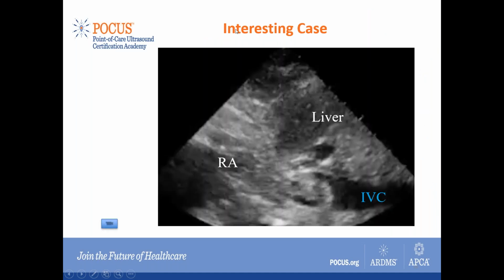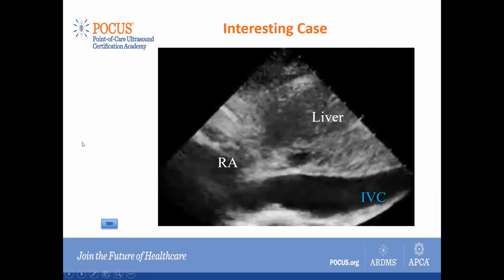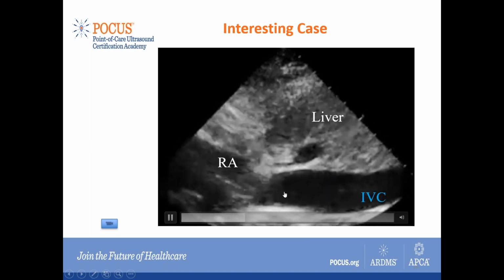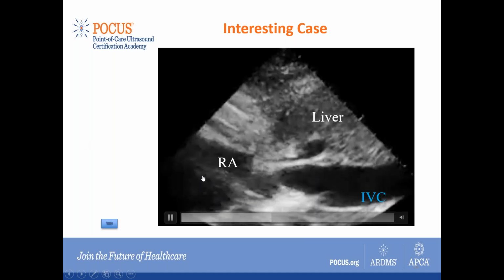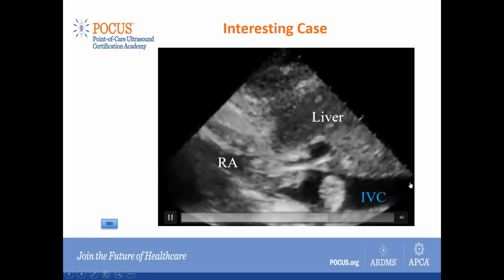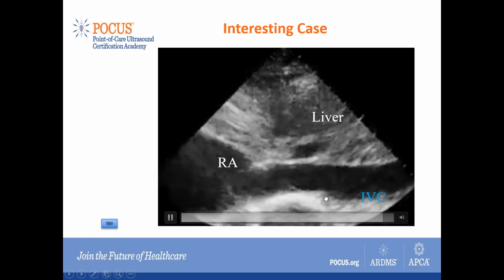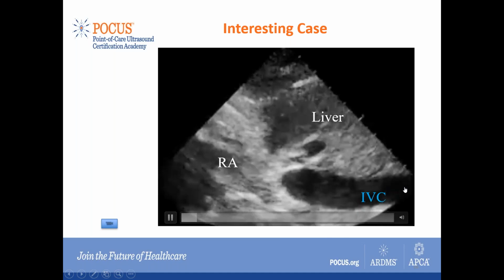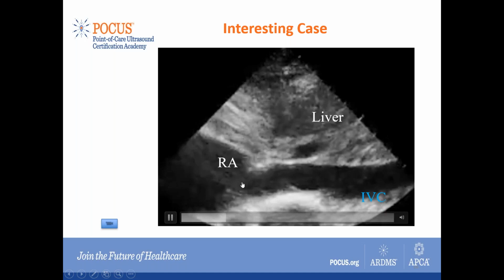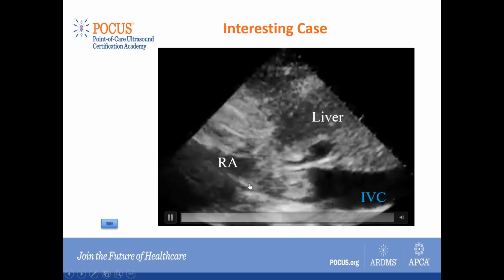Here's one video that I'm just going to share with you. Obviously, so IVC here, and you can see the right atrium over here. I think you should also look at the IVC and the right atrium if you are assessing the patient, because look at this. Nothing was found in the lower extremity, but if you can see over here, does this patient have a DVT? Yes, the patient does have a DVT. In fact, it has already embolized, and the clot is bouncing back and forth from right atrium to the IVC.